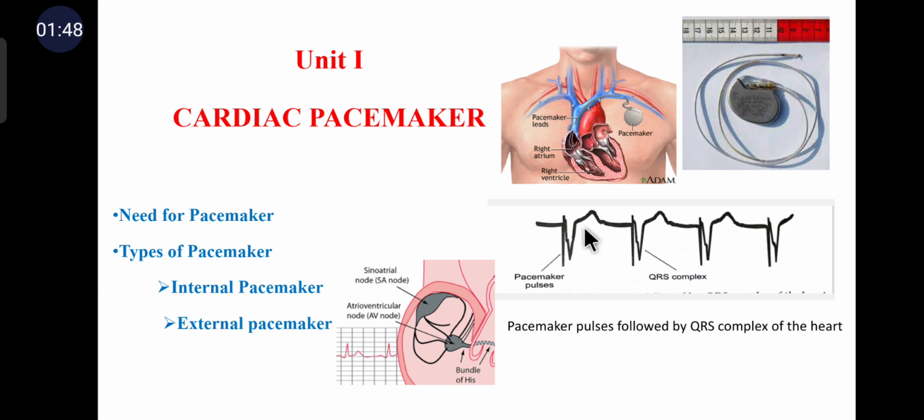The classification of pacemakers into different types is based on the mode of application of the stimulating pulses to the heart. That is internal pacemakers and external pacemakers. External pacemakers are used when the heart block presents as an emergency and is expected to be present for a short time. Internal pacemakers are used in cases requiring long-term pacing because of permanent damage that prevents normal self-triggering of the heart. In the latter case, the pacemaker itself may be implanted in the body. So, the patient is able to move about freely and is not tied to any external apparatus.